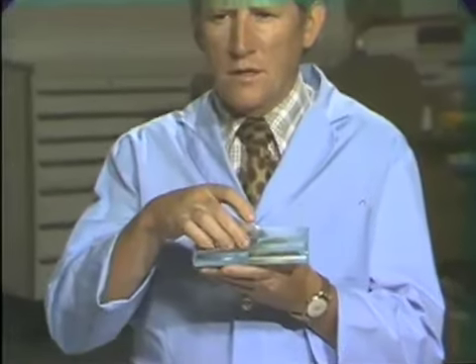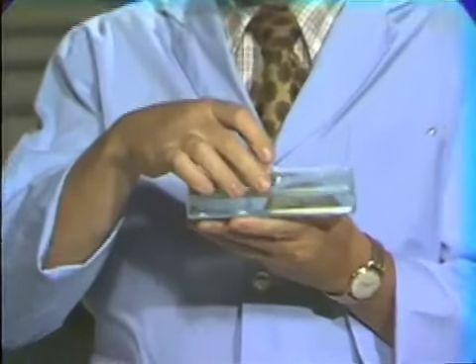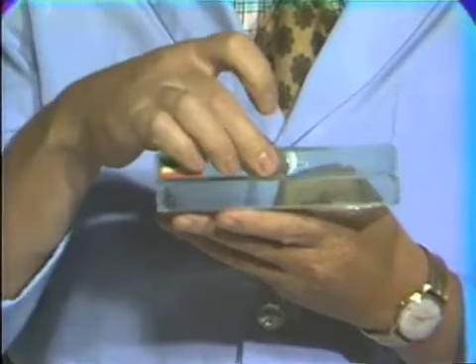One of the factors in establishing retention for our removable appliance is the interfacial surface tension. Interfacial surface tension comes from the close approximation of 2 surfaces, and we can liken the appliance on the ridge to these 2 glass slabs.